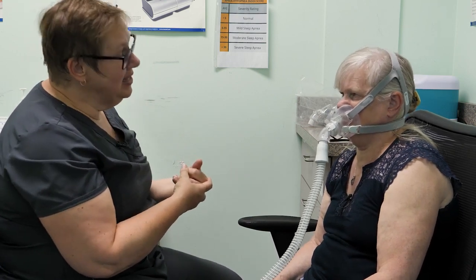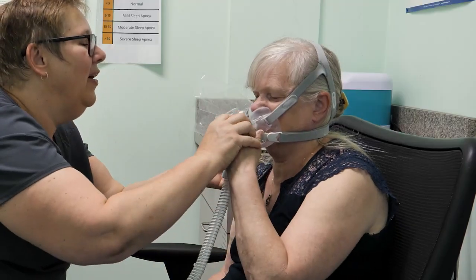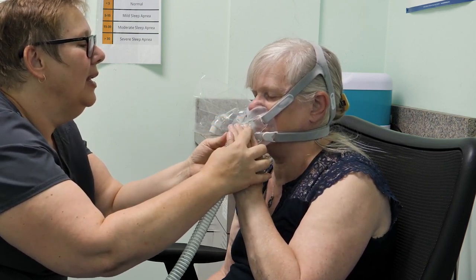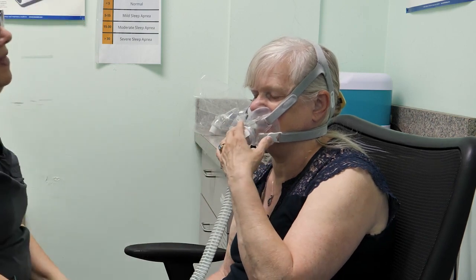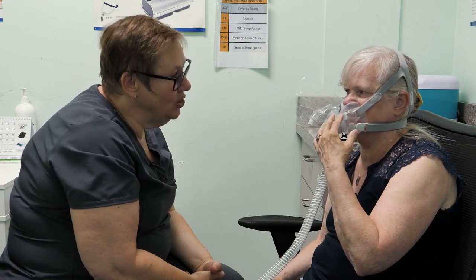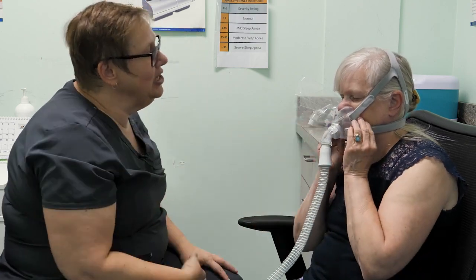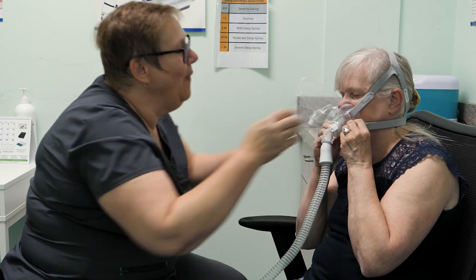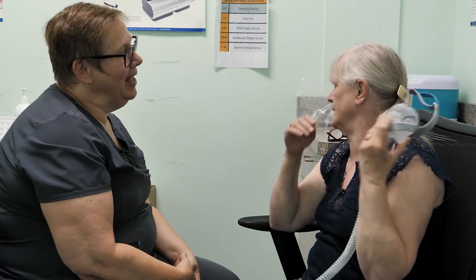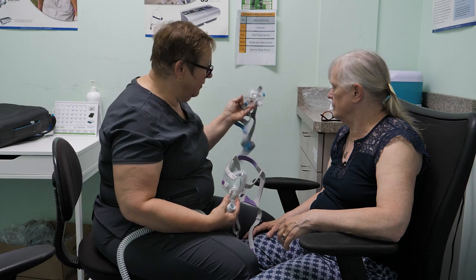All right. So with this one, I would like you to just reach up, but before you take it off, I want you to feel here. Can you feel the air around there? Just a little bit, really gentle. Yeah, very little. That is an exhalation valve, so that is where the air is coming out, and that is fine and that is normal, and you want to feel that air coming out of there. So now you're going to bring your hands up to the magnets and just undo the magnets. Nope, there you go. Perfect. And just take it off over your head. Good job, Marika. Okay, so Marika, you've already tried this one, which was the least invasive of the masks.